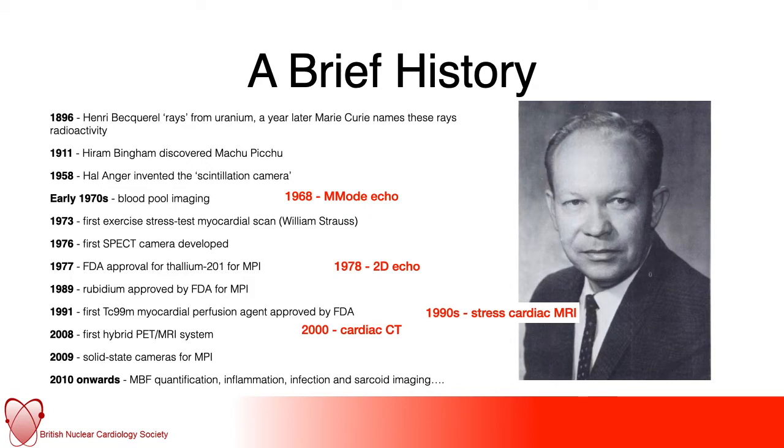So we have a wealth of evidence backing up the technique, and in fact many of the newer imaging modalities have actually been validated against myocardial perfusion scintigraphy, so that's important to bear in mind as we go through these few slides.